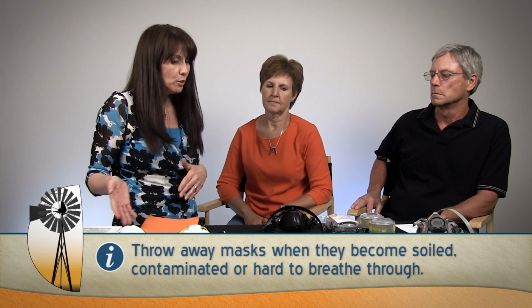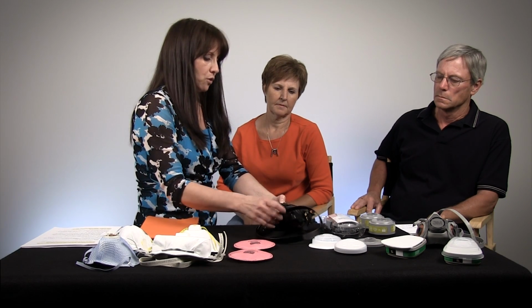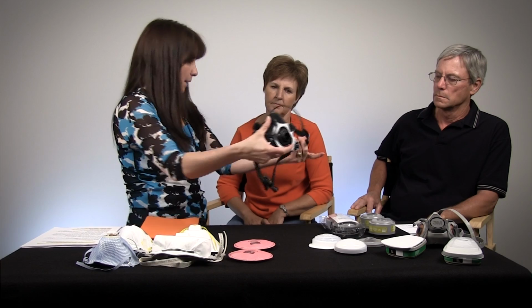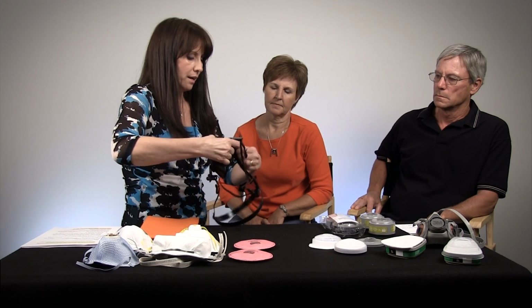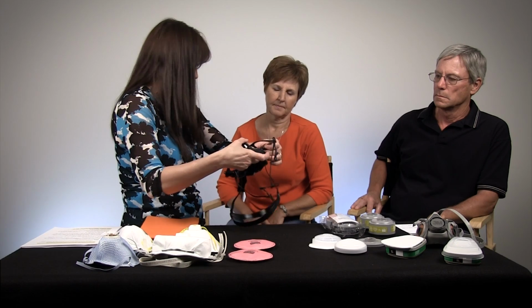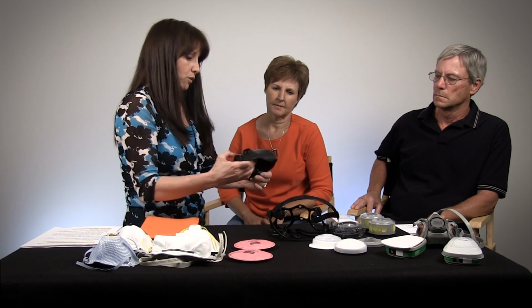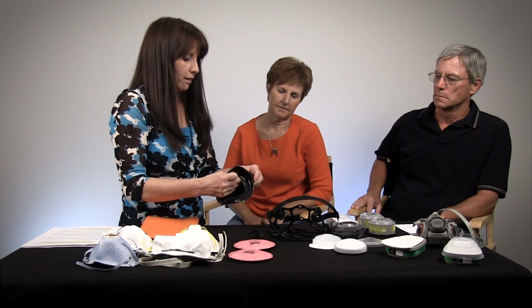And then when you begin to move on to a different type, the half mask respirator, there's really a lot of other things you can do to take proper care of them. So with this mask, for example, we have these type of straps. As you pull on these repetitively, those straps can wear out, or the cradle wears out, so that can be replaced. That's one of the first things you can look at. Also, the mask comes completely apart. So when we say care for your mask, we actually mean wash it. You can wash it with hot soapy water, dish soap, and let it air dry.